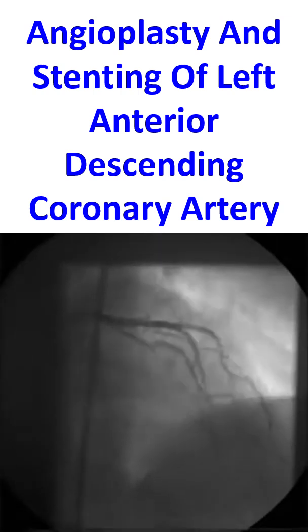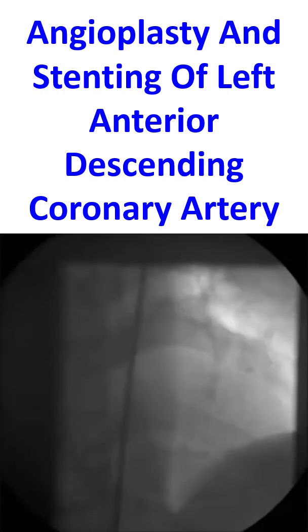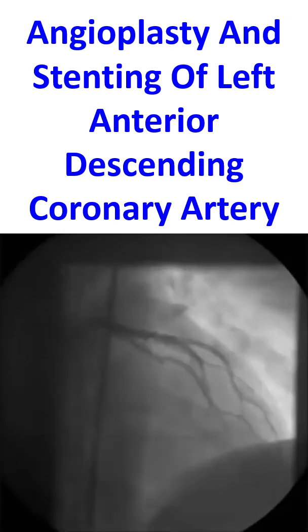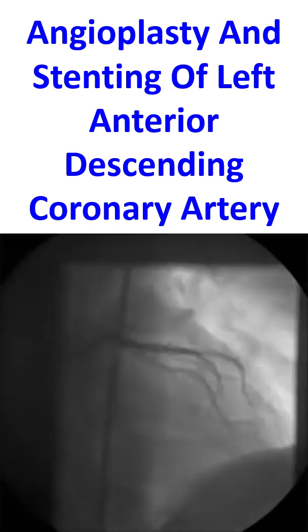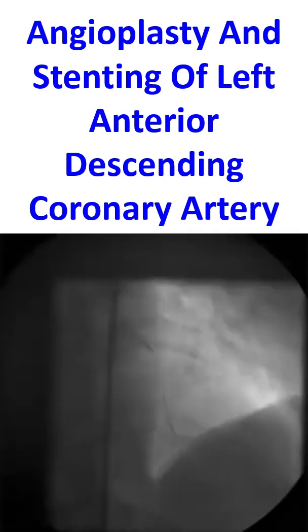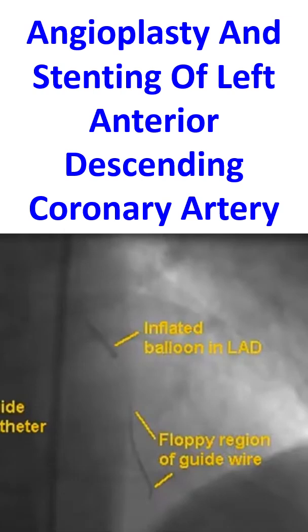Here is a summary of what you are seeing on this video clip. It's an old video clip showing PTCA followed by stenting of a total occlusion of the LAD.